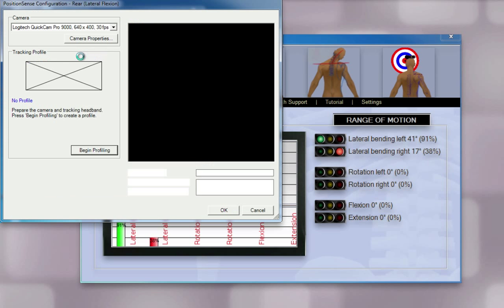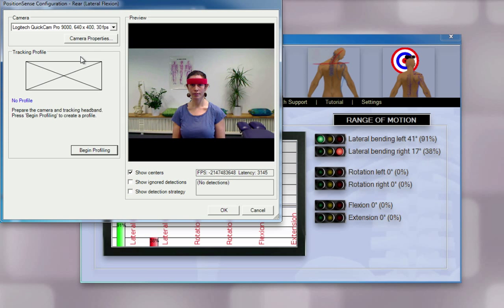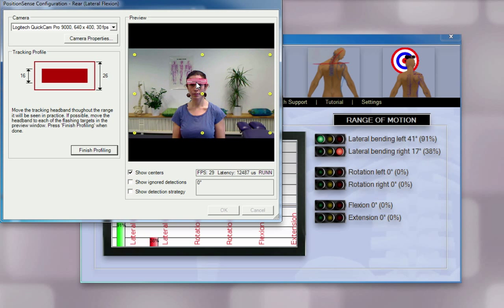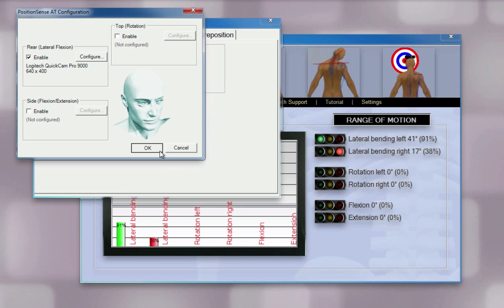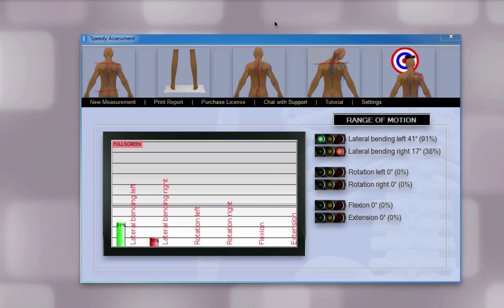Click Configure. Now, place the headband on the patient. Click Begin Profiling. Now click on the headband itself. Once the headband is highlighted, click Finish Profiling and then OK.